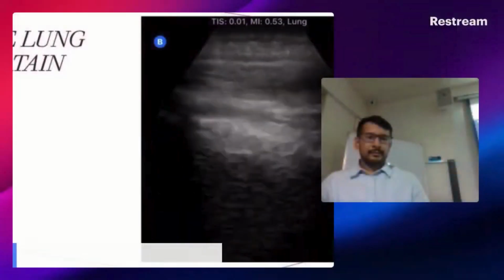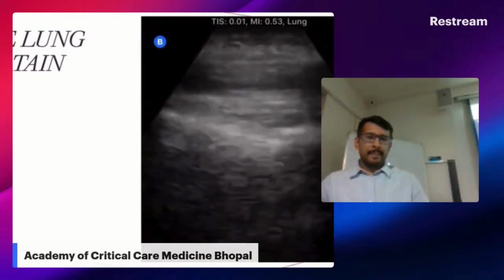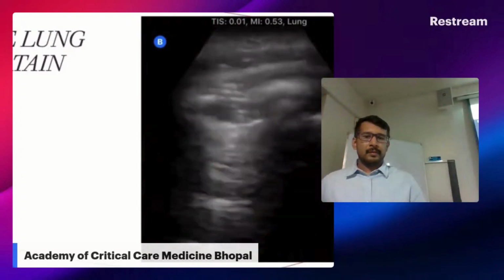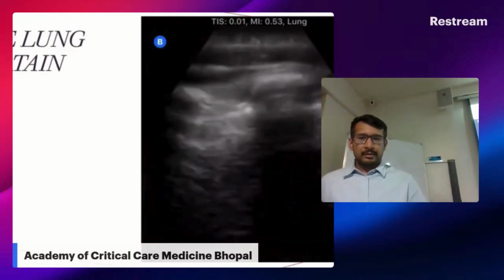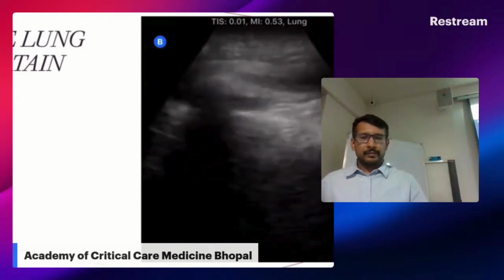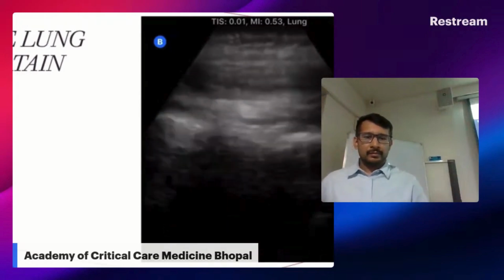Between the thorax and the abdomen, we see the lung curtain. So the patient breathes in, it comes down, obscuring the abdominal organs, and they breathe out, and it goes back up, revealing them again like a curtain. And it's at the point of end expiration that we would mark the level of the diaphragm, because we want to make sure we're above or cephalad of that point.